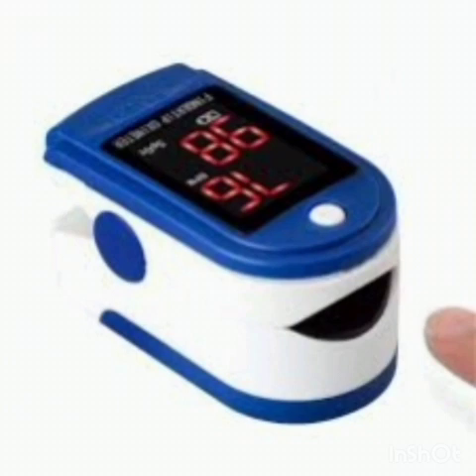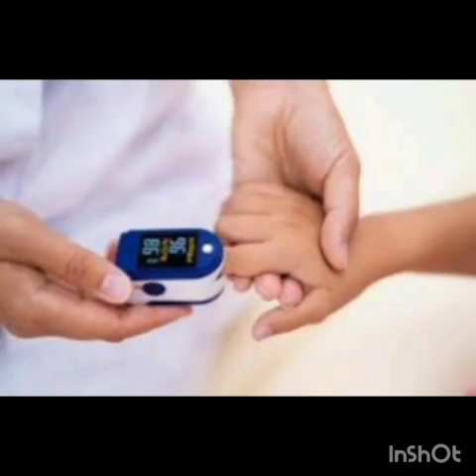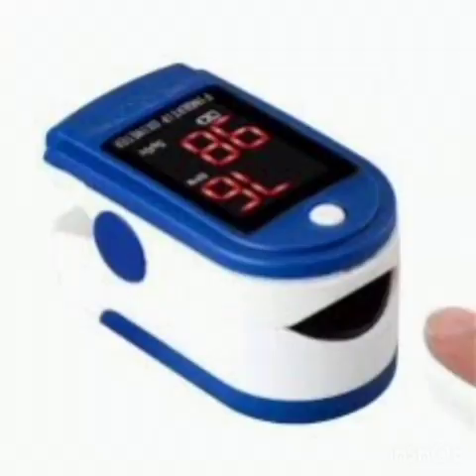Then the pulse oximeter gives a rapid measurement of the oxygen saturation level in your body without using a needle or taking blood samples. The amount shown on the screen reflects the saturation of the red blood cells with oxygen. The normal range is 95% to 100%.